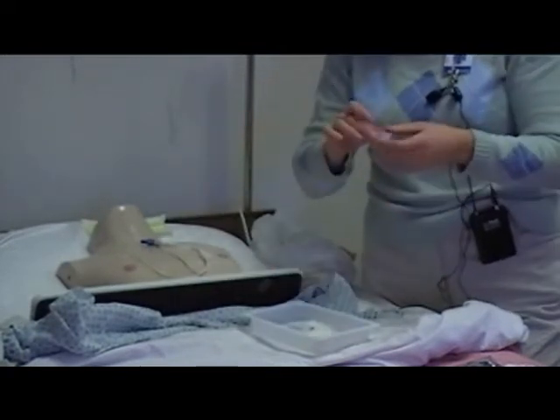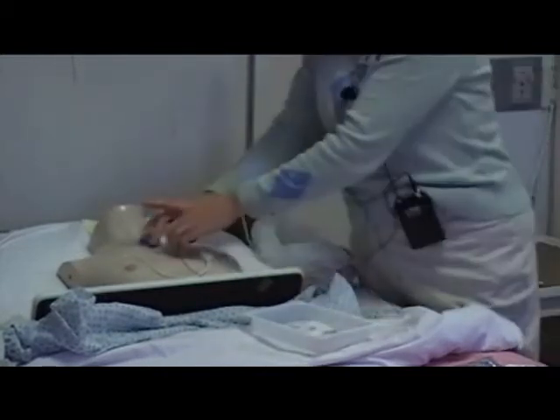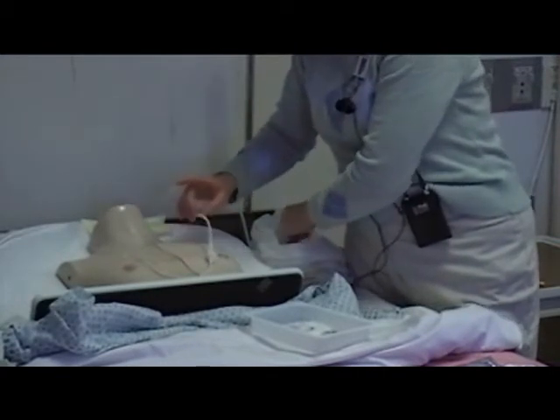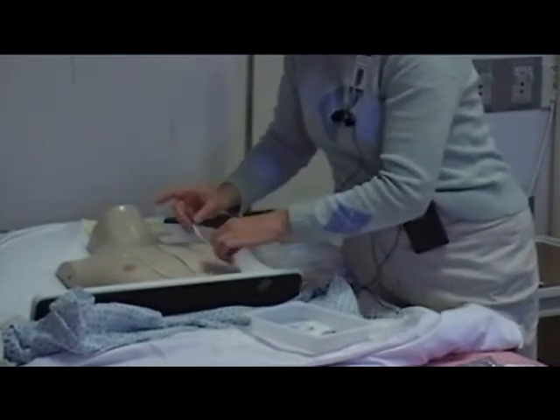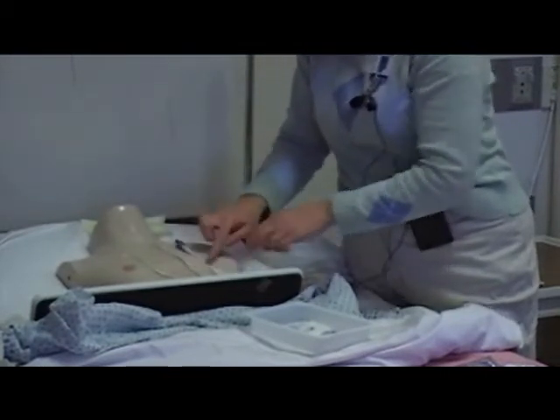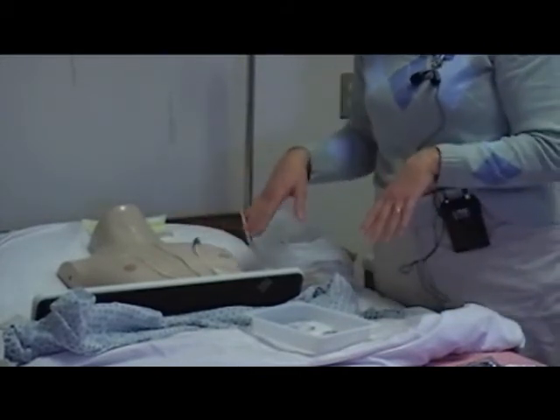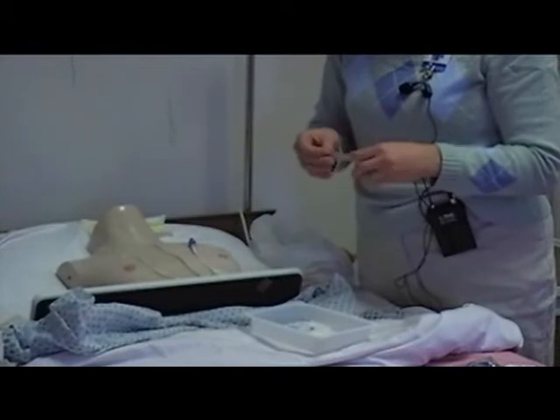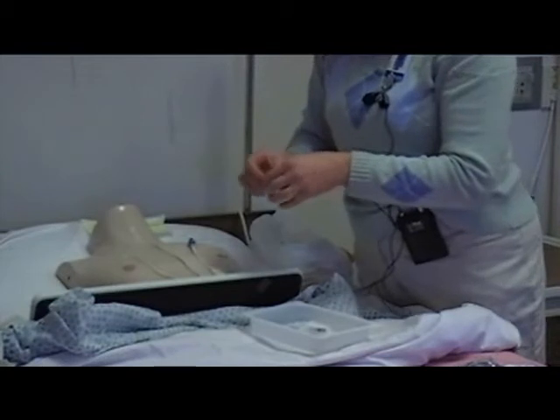You also have some tape in there. How I'm going to use the tape is I'm going to just move how this catheter was laying so that his skin gets a little bit of a break there. And I'm just going to put a small piece there. It's just a security tape so that it doesn't accidentally get caught. You'll do that on somebody whose catheter is not actually being used at the moment. If it's being used, you usually will not do that. And this is something else you can do, but you won't always have to. If you're having problems sealing at the bottom, I'll tear off a small part.